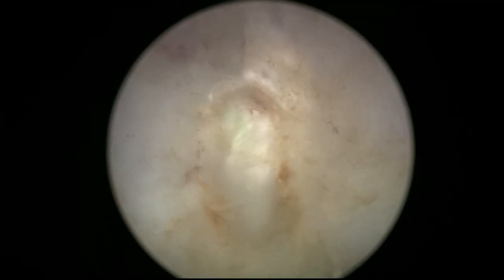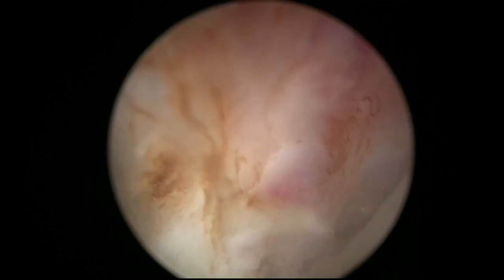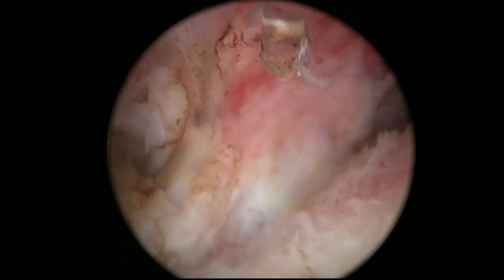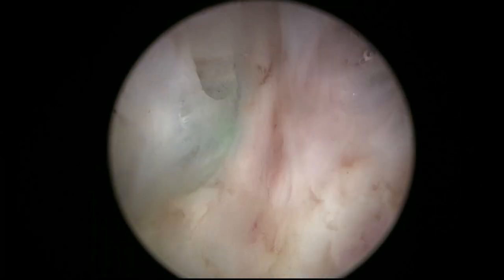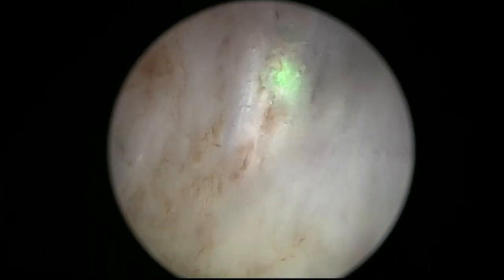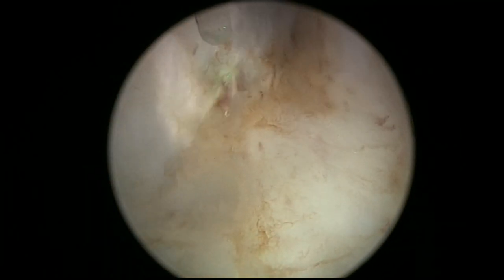We know that when you remove the adenoma completely, the clinical results are going to be excellent and the recovery of the patient is going to be excellent. We saw that with open prostatectomy, with laparoscopic and robotic — whenever you remove the adenoma completely, patients really improve their voiding symptoms and their bladders tend to recover better. So we stopped being enemies, although there are some very strong proponents, for example, of Thulium fiber laser over Holmium, and sometimes there are still arguments to defend one over the other.